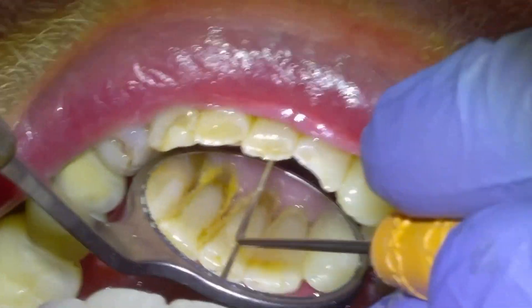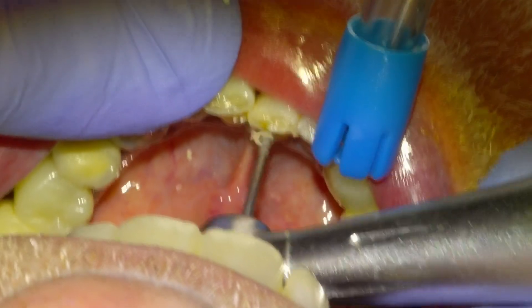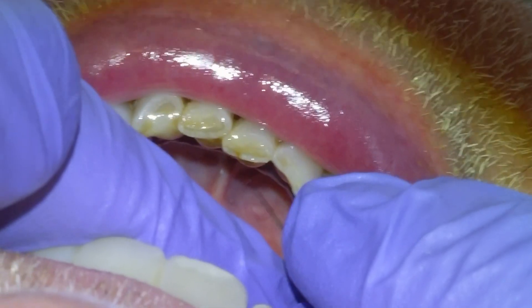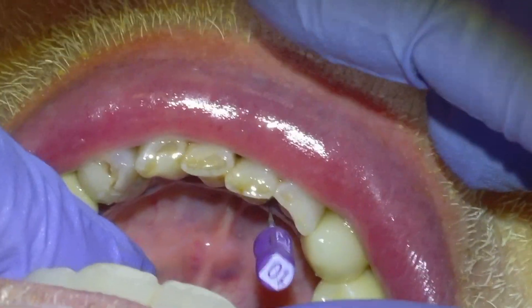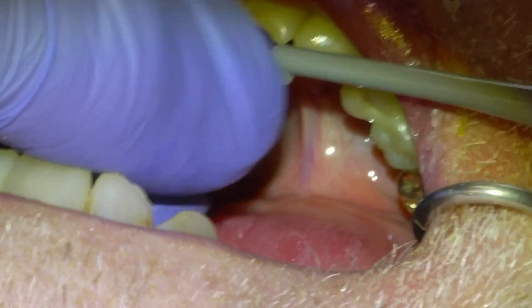We'll use an explorer until we get a stick, and then once we get a stick we'll open up the pulp chamber with a Munce Discovery burr. Then we'll take a 10 file, just make sure that we can get a 10 file in and take it down to length until we are slightly out the apex.